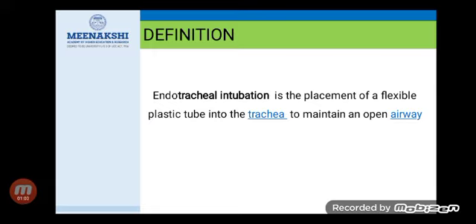We'll discuss what is endotracheal intubation. It is the placement of a flexible plastic tube into the trachea to maintain an open airway. So it is called endotracheal intubation.